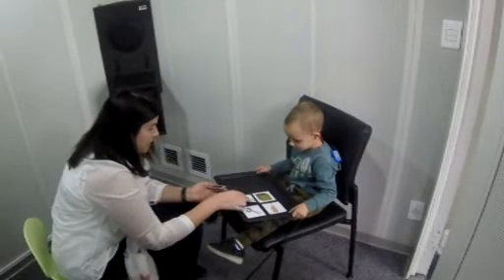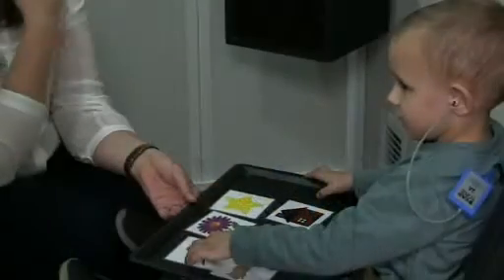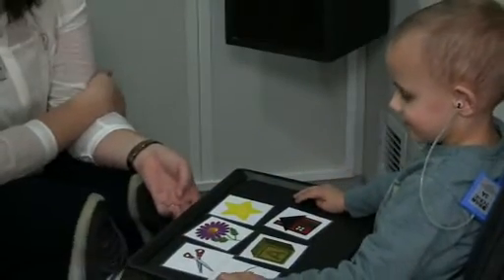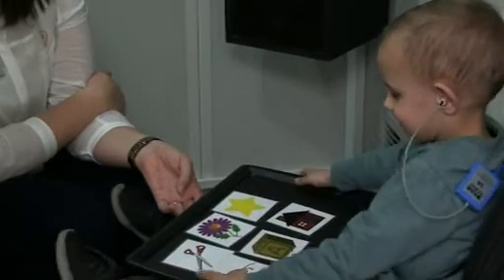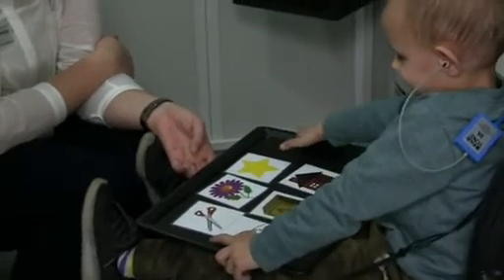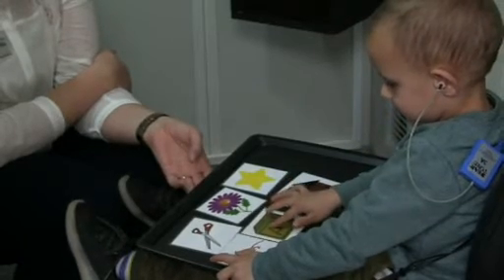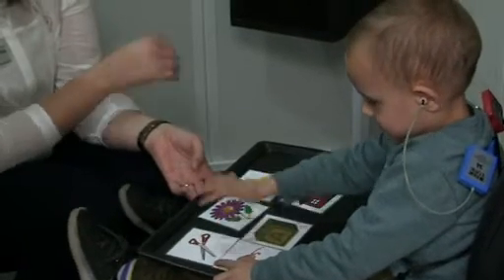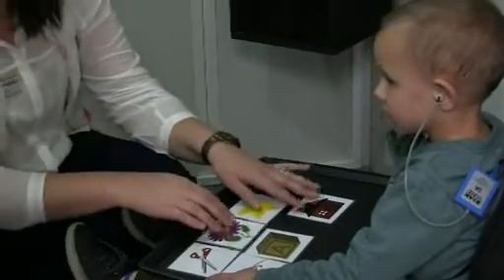After all pictures are introduced, the assisting or testing audiologist should first test if the child is familiar with all the testing pictures by asking the child to point to each picture. Remove any item that is not familiar to the child as well as its corresponding pair. Repeat the teaching procedure and ensure the child is familiar with all minimal pairs to be tested. The test can now commence.